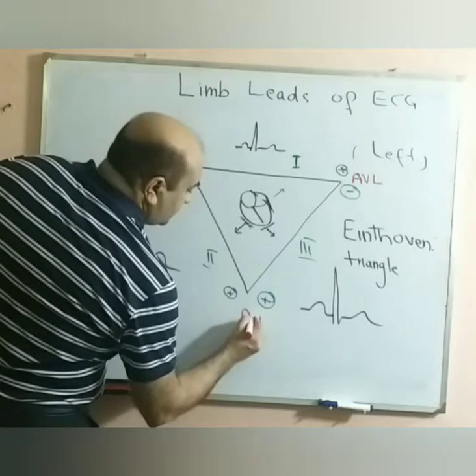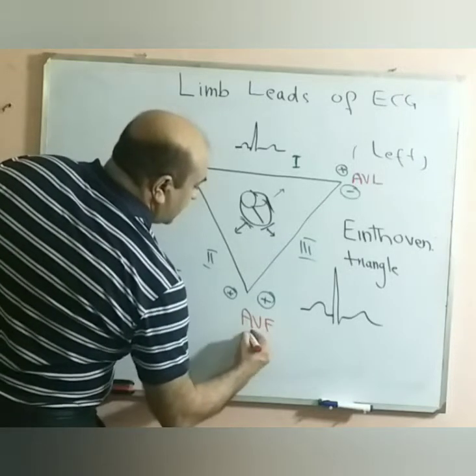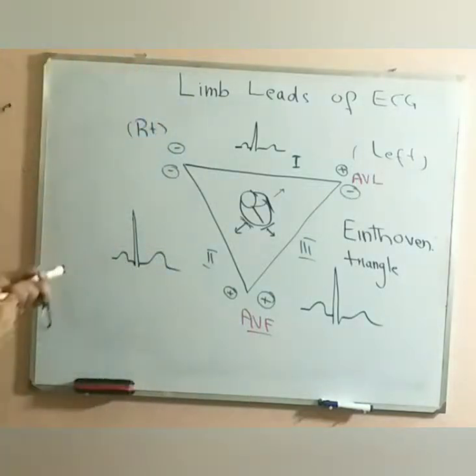Between lead 2 and lead 1, this area was uncovered. The heart has a very small strip on this side, because it is placed anatomically in the chest in such a way that a very small strip is located posteriorly, but obviously the posterior part of the right side of the heart is an area which was uncovered.